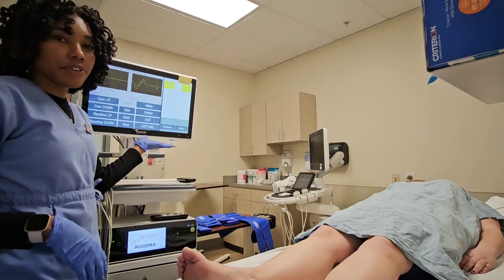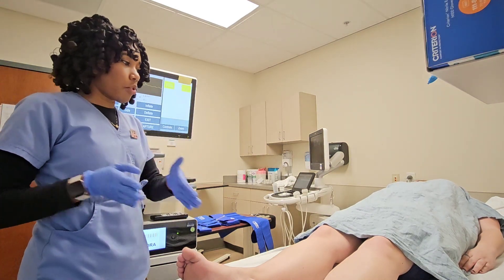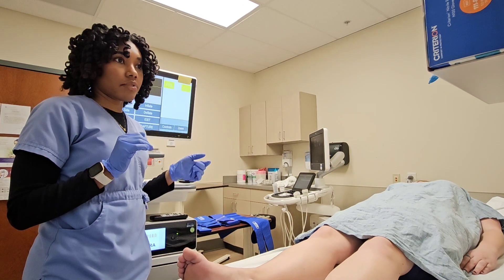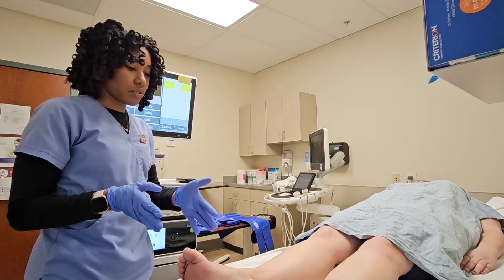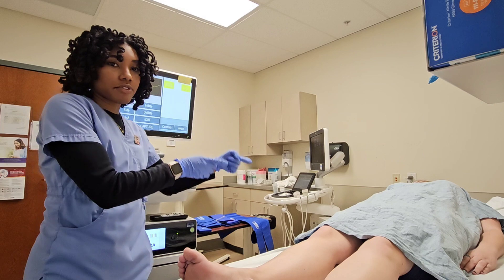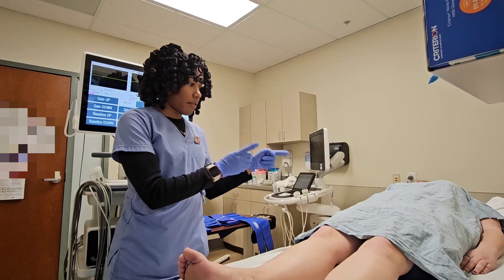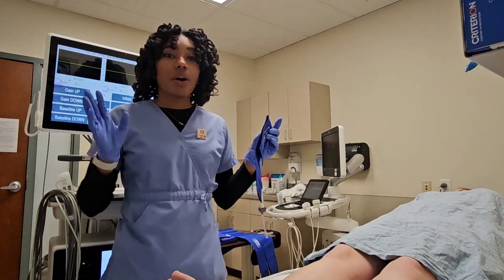These machines are pretty self-explanatory. I start usually with the feet and work my way up getting all the cuffs. Some places will do only a three-cuff method, and that's what we do here for the legs. But then we also do the metatarsals. Some places will have two cuffs for the thigh level. We're going to do metatarsals, ankle, calf, and thigh. We've got the big thigh cuff.